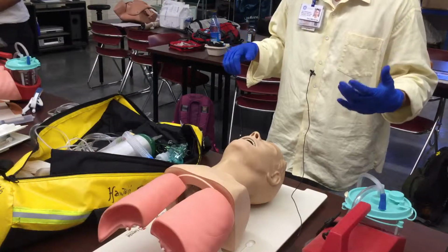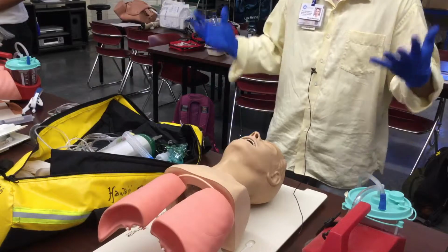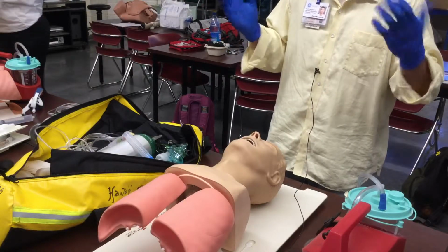Station, check out your equipment. You don't really see a prompt. It's just oxygen administration. This is the KCC skill sheet. Take proper BSI.